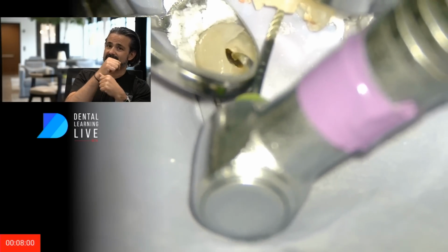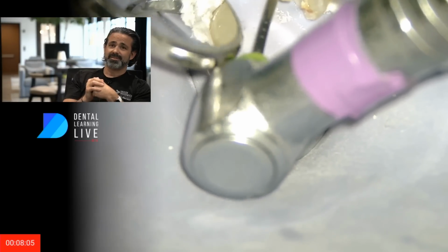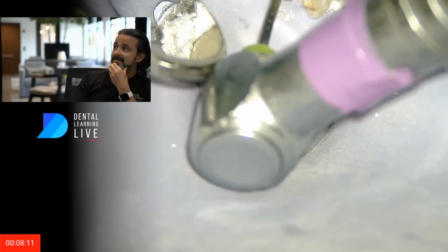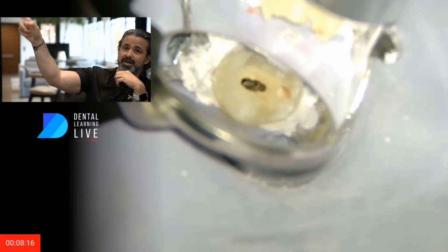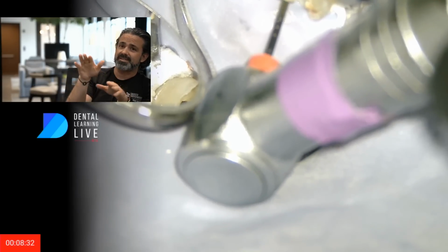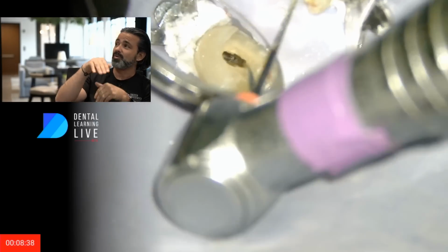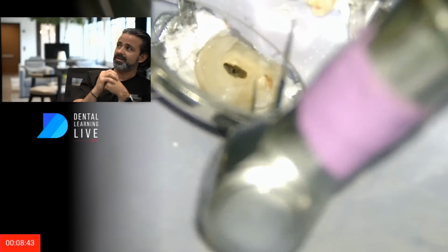And it does feel like it's starting to catch, just starting to flicker right there. Let this puppy progress. Okay, now you can kind of see it. You see the little black spot right there? That's the lingual canal. So it's really a buccal-lingual bifurcation. Sometimes I've seen them where they're mesial-distal or off-axis a little bit. I'm fortunate when there's buccal-lingual, it's a little bit easier because I have more references from my cusps when I pre-bend a file and I try to go in there. And so it's taking a bite right there.